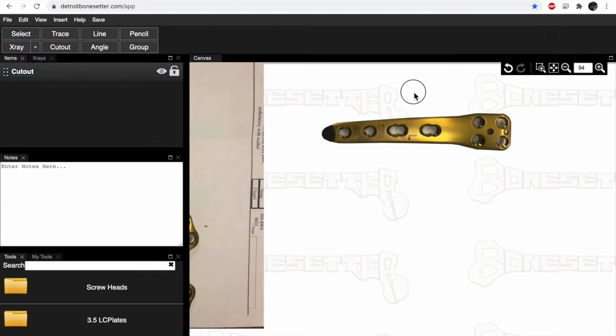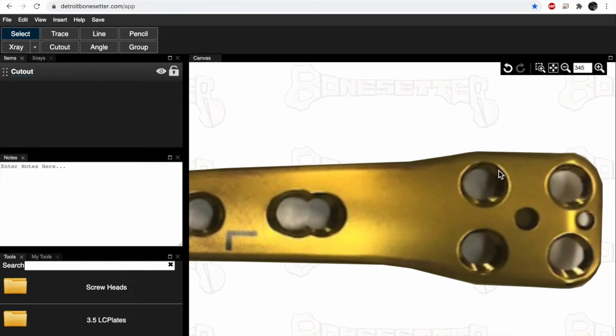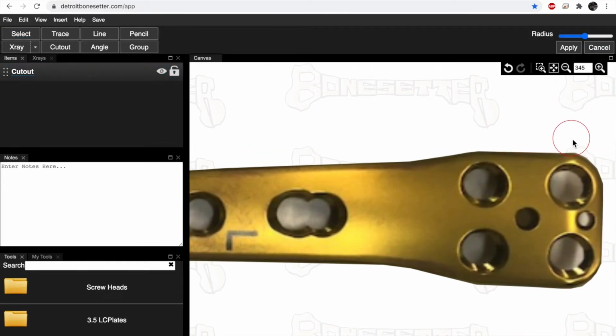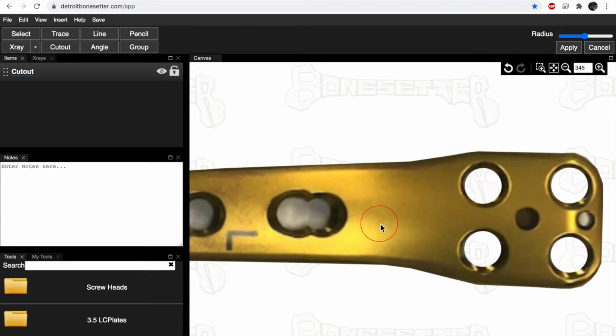Before I do that, let's make this a little bit bigger so I'm a little bit more accurate. So again, I pick it, and this little eraser, I'm going to pick that, and you see these circles. I can change the size of the circle, and this is an erase tool. So look, it's small. So I can do this, and that erases parts of it. Or I can make it a little bit bigger. So let's say it's the size of the circle, which is about here, and I can erase the whole area. Now if I pick the size of the circle, I can go through, and now I can pick areas, and you see I can see through it.